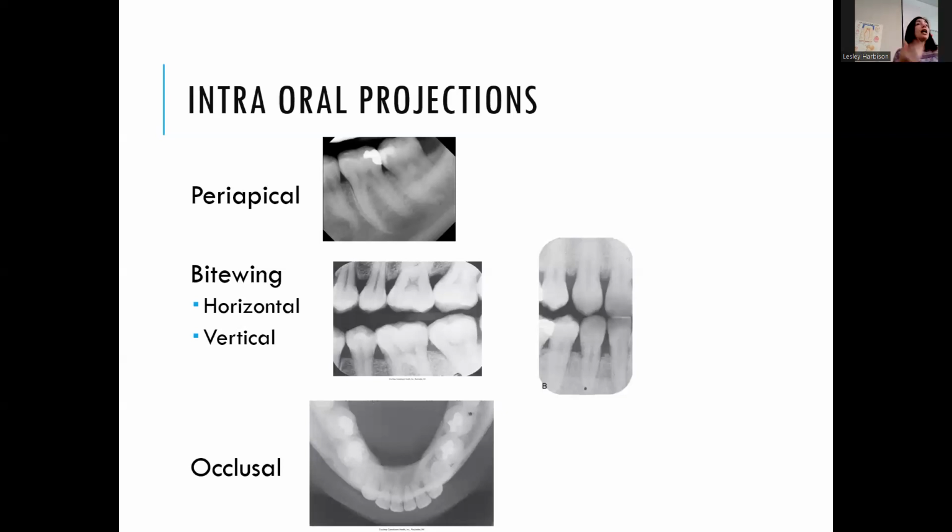Yeah, you could. A lot of times, when I first started, I would just take 2 bite wings, and then I would take a maxillary occlusal film and a mandibular occlusal film, and just come in at these sharp angles. Very often you'd take it on kids that way too.